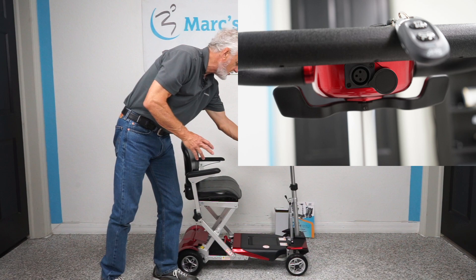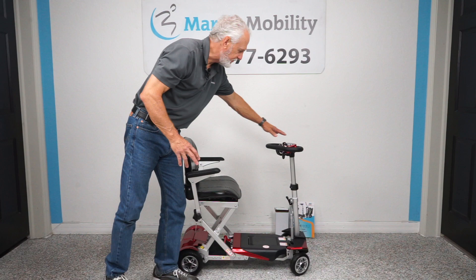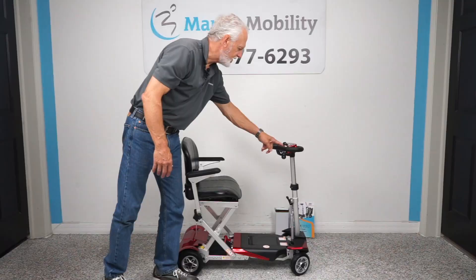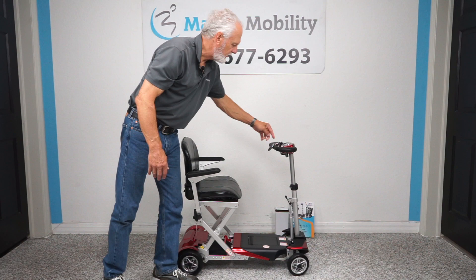From the front you now have a digital display, and you can also fold the scooter without the key fob — from the front instead of having to go to the back like you used to. There are two buttons in front: one says open, one says closed. So if you don't have your key fob right here, you can always do it through these two buttons.